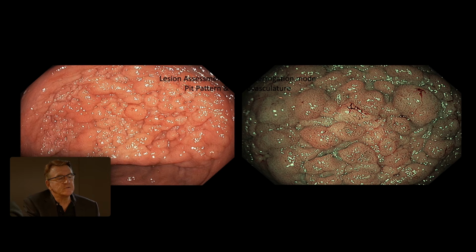So you can see that it's a homogeneous lesion. It's flat and it's multinodular. So this is a granular lesion. It's like a bowl of rice bubbles. It's flat. So then we say it's a Paris 2A lesion.